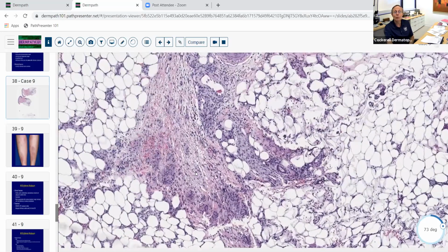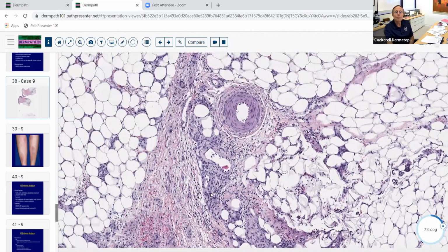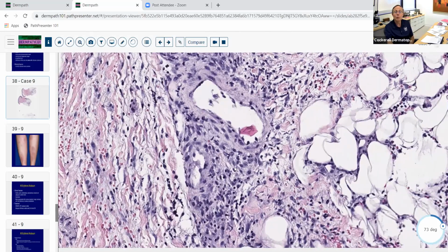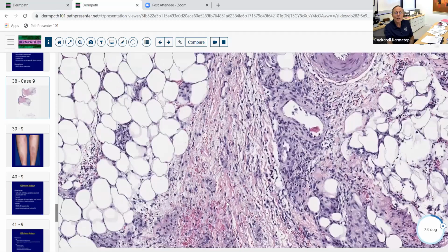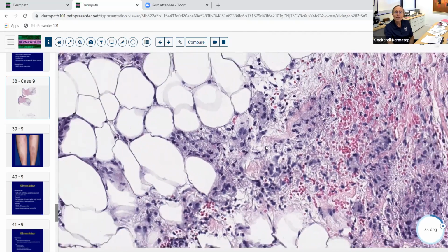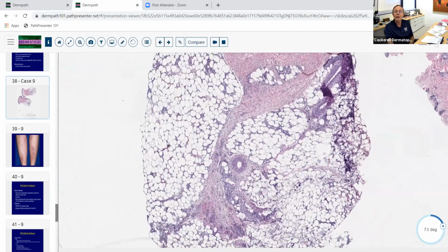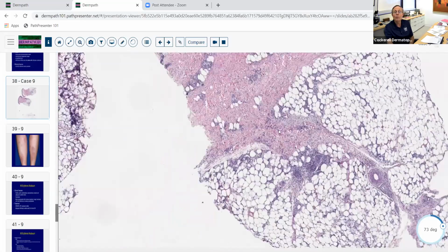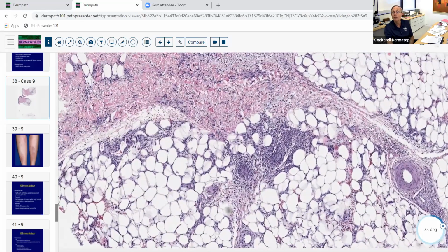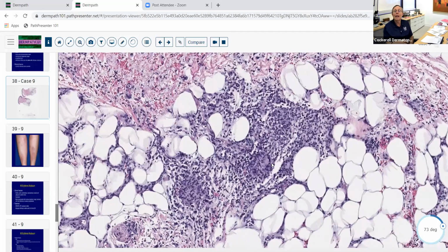We see this inflammatory infiltrate again, and we ask ourselves what kind of inflammatory cells are present. We've got histiocytes, some neutrophils, we might even have some eosinophils here. We've got some histiocytes over here, some of them a little bit foamy. And the histiocytes form a little cluster of granulomatous inflammation right at the periphery of one of these thickened septa. Normally septa are one collagen strand thick. This is markedly thickened up here. People talk about that as being Miescher's radial granuloma.